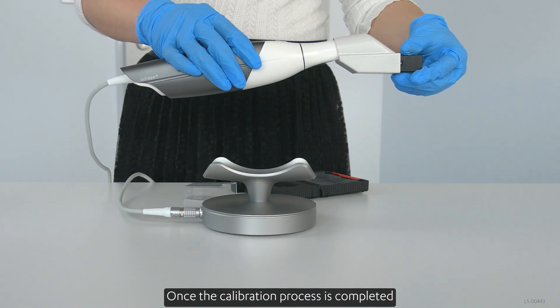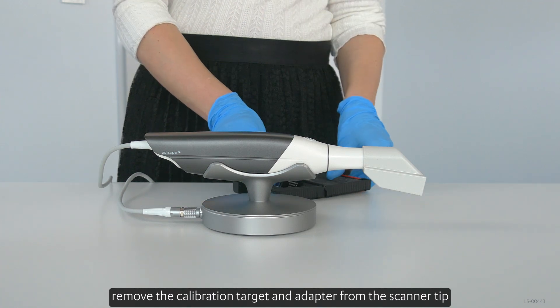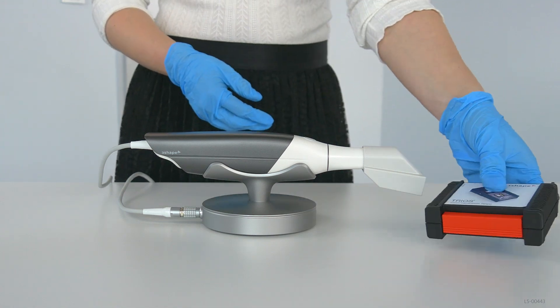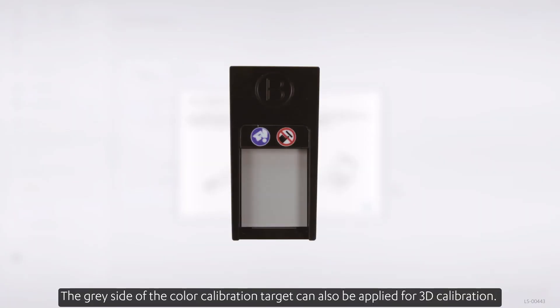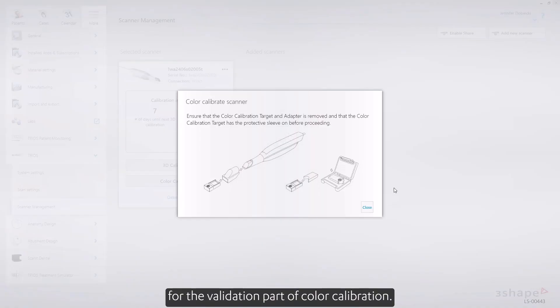Once the calibration process is completed, remove the calibration target and adapter from the scanner tip, and put the target into its sleeve. The gray side of the color calibration target can also be applied for 3D calibration. For this purpose, simply follow the steps described for the validation part of color calibration.